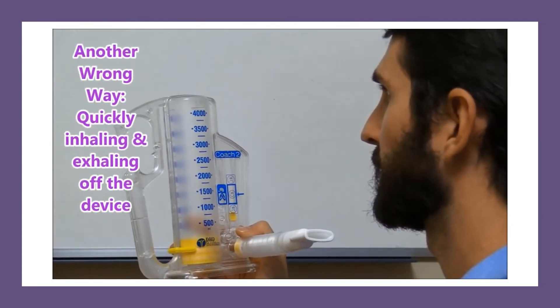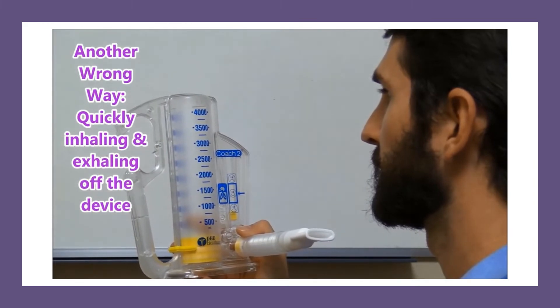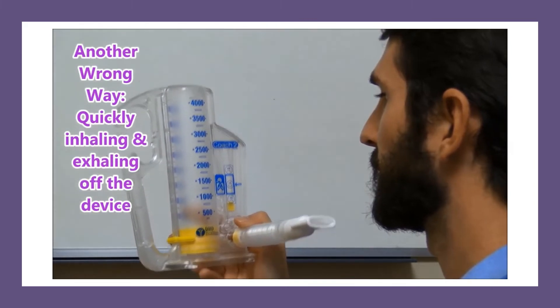Another wrong way patients may try to use an incentive spirometer is by quickly inhaling and exhaling off the device.